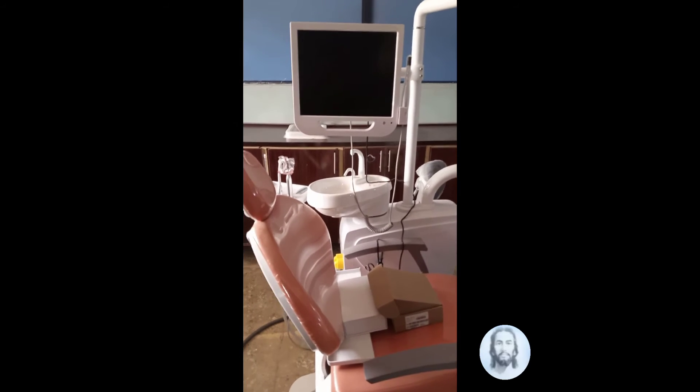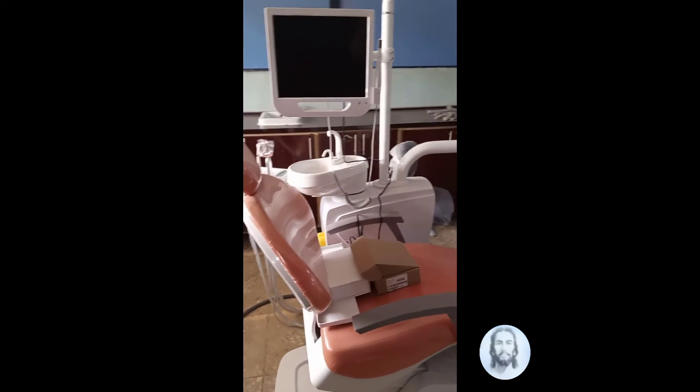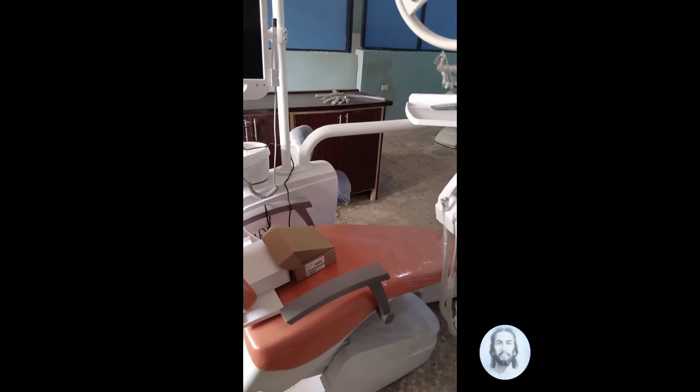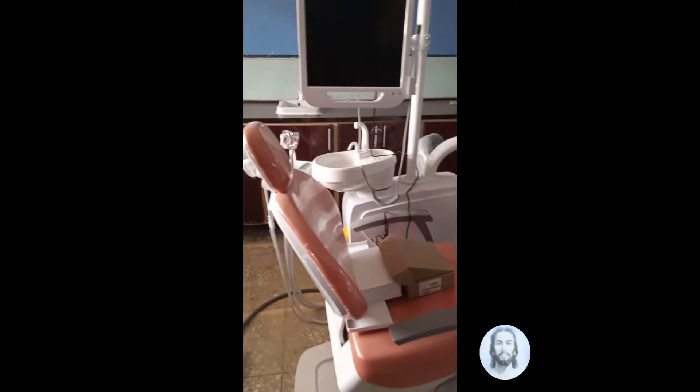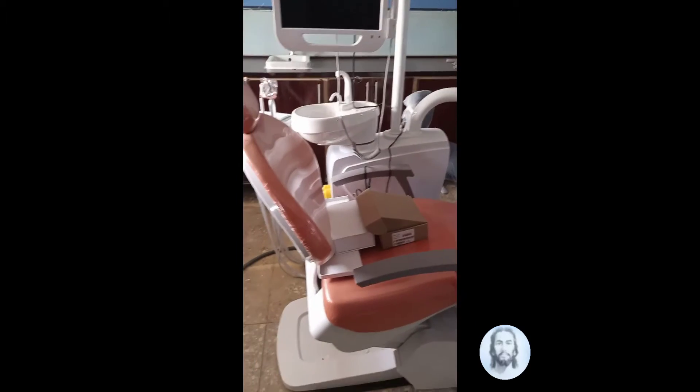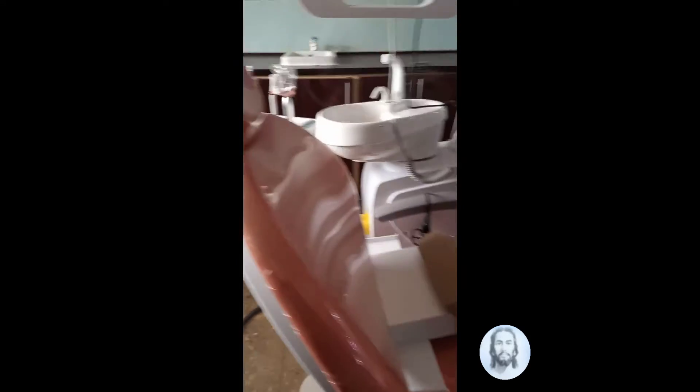Here again we have our dental unit with a unique dental chair, different from the previous video. Here is the dental chair for the patient to sit comfortably while dental procedures have been done.